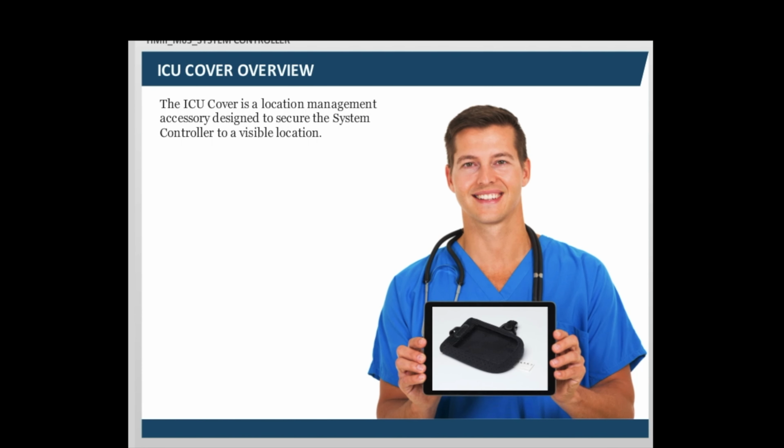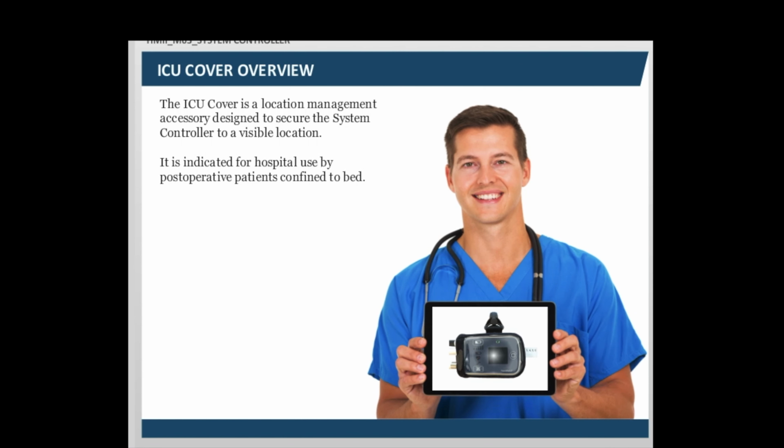The ICU cover is a location management accessory to the HeartMate 2 LVAS and is designed to secure the system controller to a visible location, such as the patient's gown or bedsheet, using the provided clip. It is indicated for hospital use by post-operative patients, typically in the intensive care unit. This disposable, non-sterile product is only intended for use when the patient is confined to bed. Do not use it when the patient is ambulatory or at home.